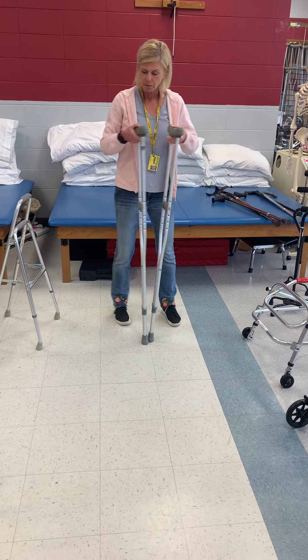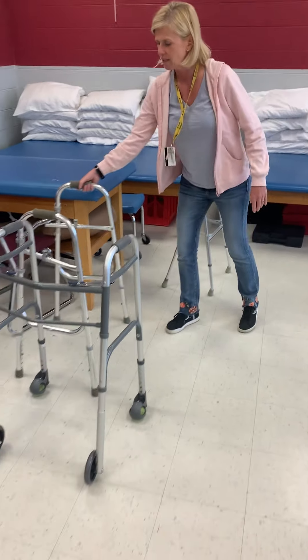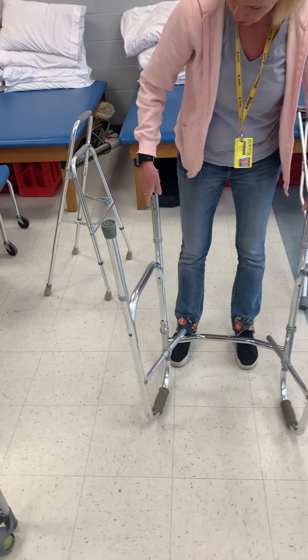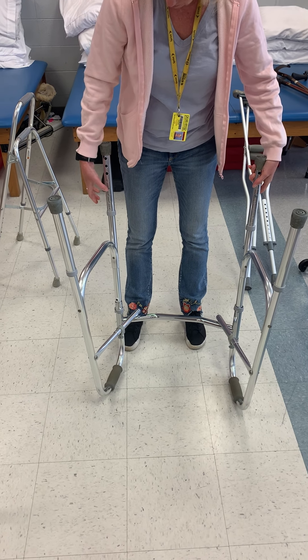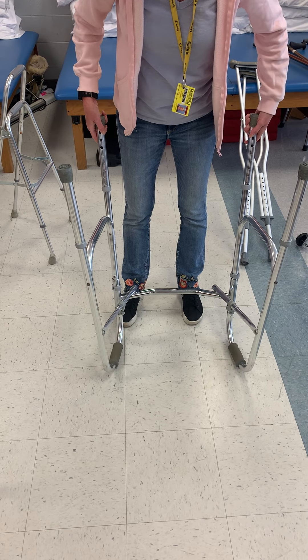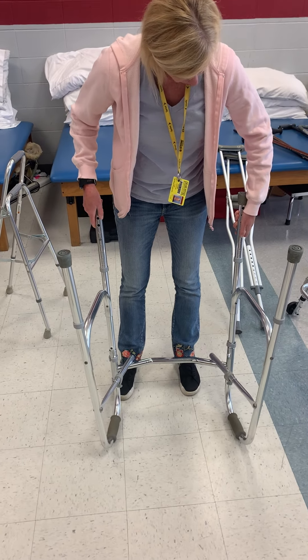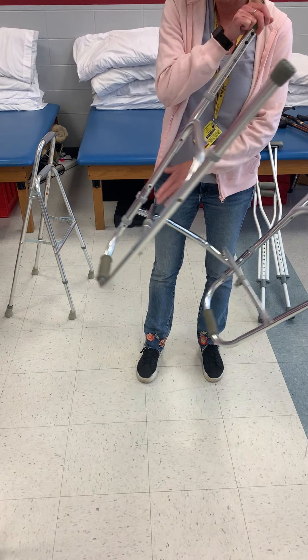Let me go back to this walker real quick. In order to adjust the walker, all you do is turn it upside down, push the little button in, and you can raise or lower it. Believe me, you're going to be adjusting a lot of walkers.